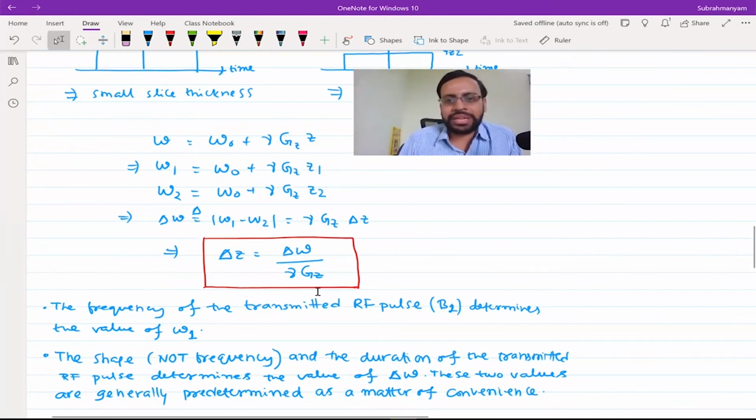These are the two things that we are discussing here. When it comes to the bandwidth, there are two aspects. One is omega at which you want the response. The second is the tolerance level within which you could get a response there.